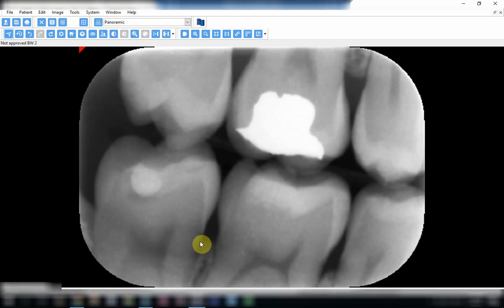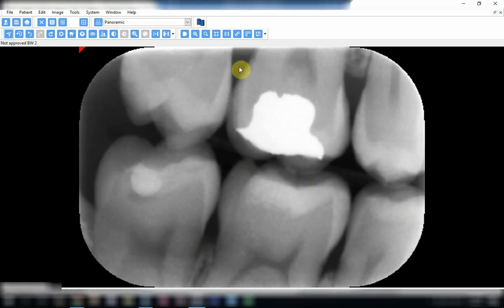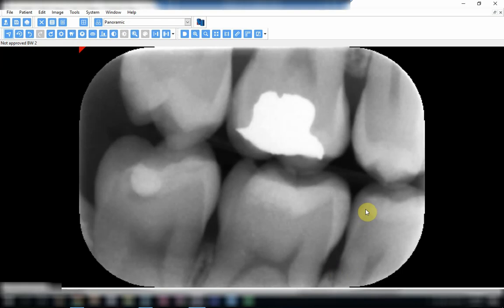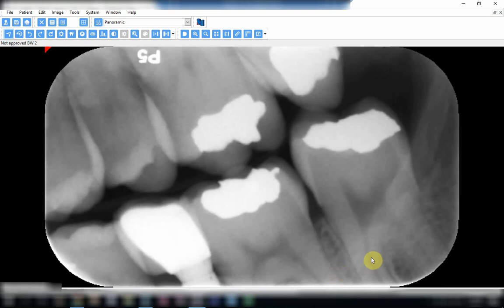What we need to take care of next time is that the film position should follow exactly the same curvature of the teeth, so that we get equal coverage of the upper and lower teeth. As it is, the distal area of the upper seven is not shown and the alveolar crest barely shows in that area. We need to ensure the film takes the same curvature of the arch.